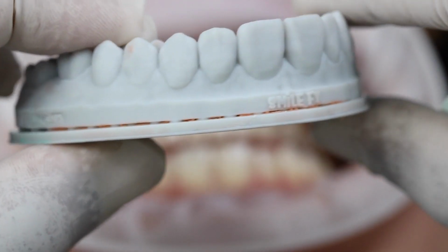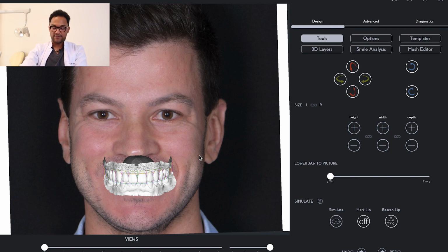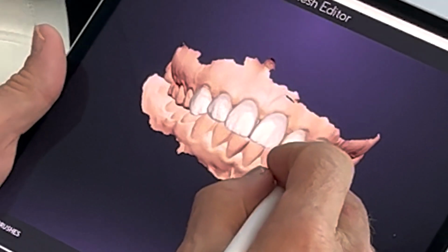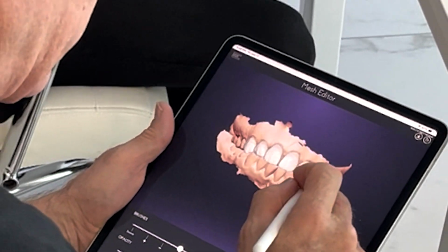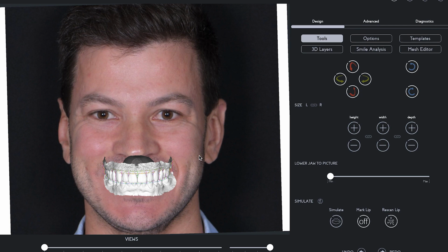If you want to digitalize your dental workflow, the best way to get started is by understanding how to create 3D dental mock-ups. With SmileFy, instead of outsourcing everything to your dental lab, dentists now can create their own in-house dental mock-ups that are not just any type of dental mock-ups, but one that is facially driven.